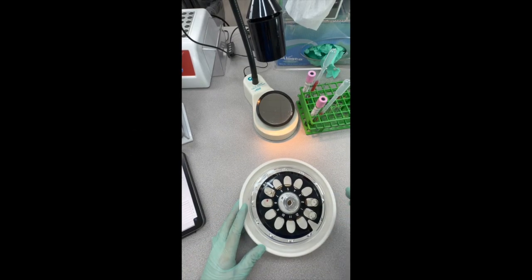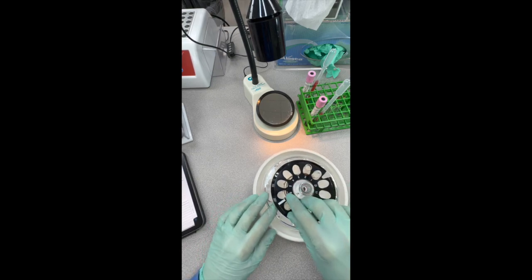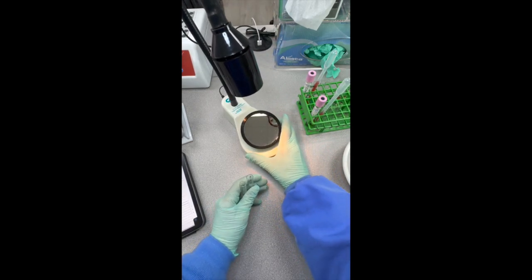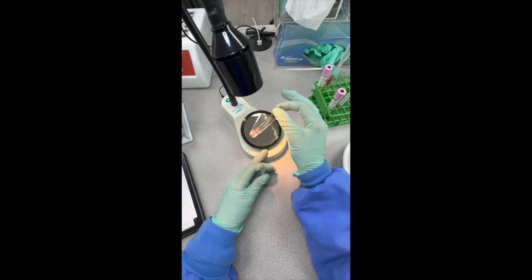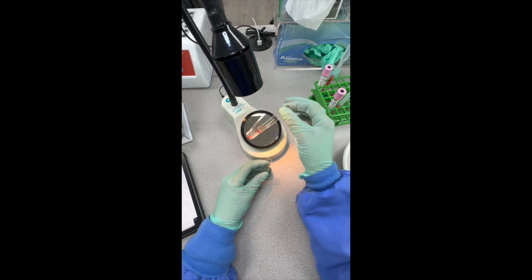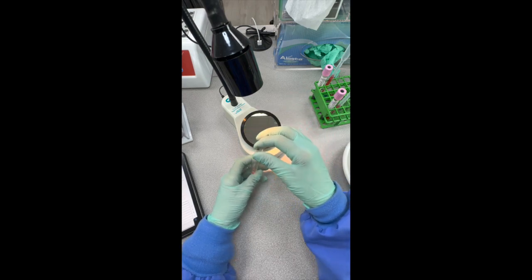Okay, our tubes are out of the Serofuge. We're going to go ahead and read these, and we're going to read H first. This is our H patient. Use our agglutination viewer. Make sure you have a good view of that. Shake and tilt. These are streaming right off of there. Looks pretty good. Shake and tilt, and again, that's a nice stream of cells off there for negative reactions.